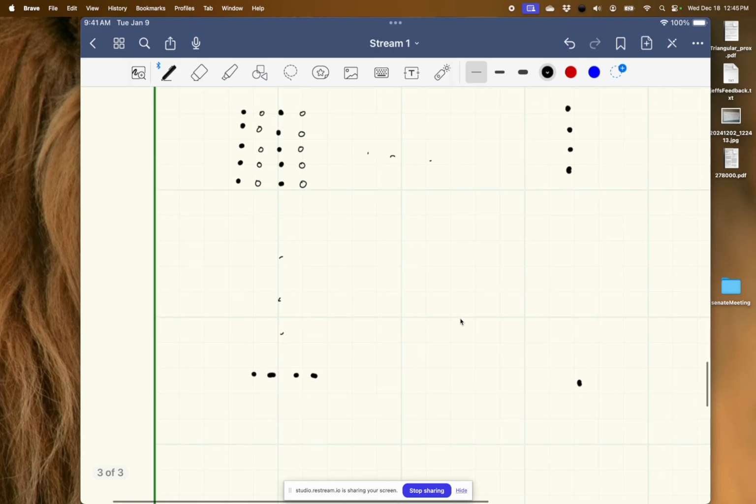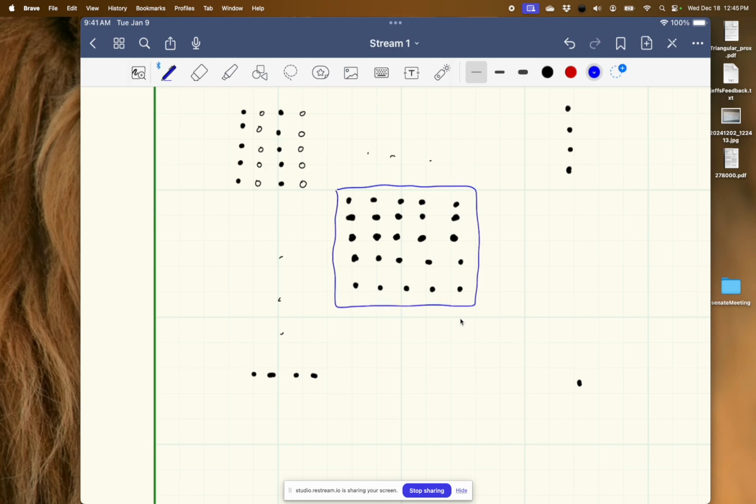So where do these weighting coefficients come from? Well, we're going to choose a center region, a region centered on 0 frequency, and we're going to fully sample it. People often call this fully sampled region the auto-calibration region.